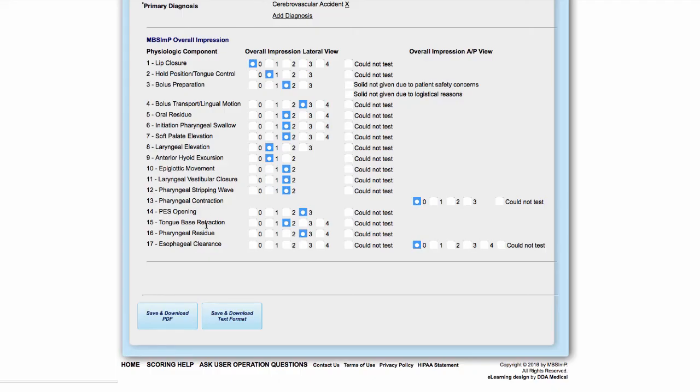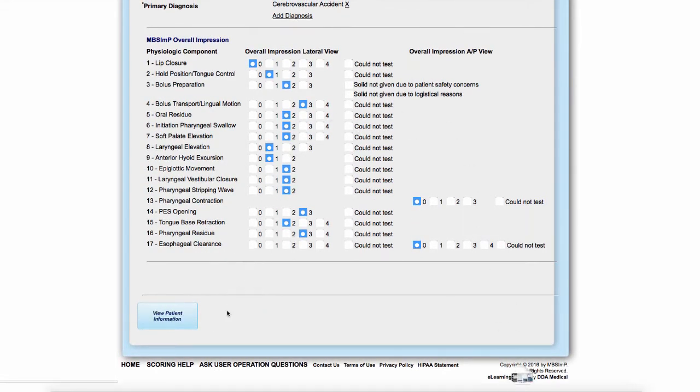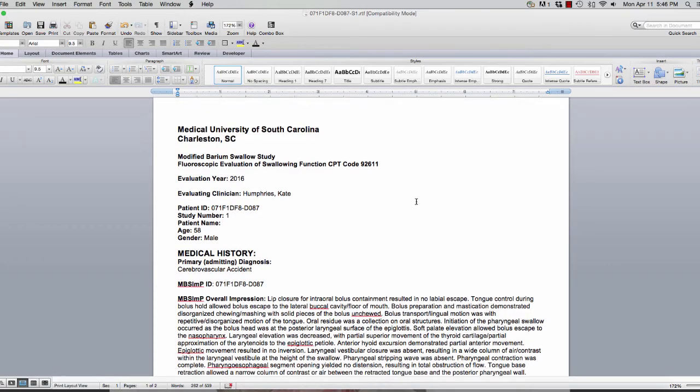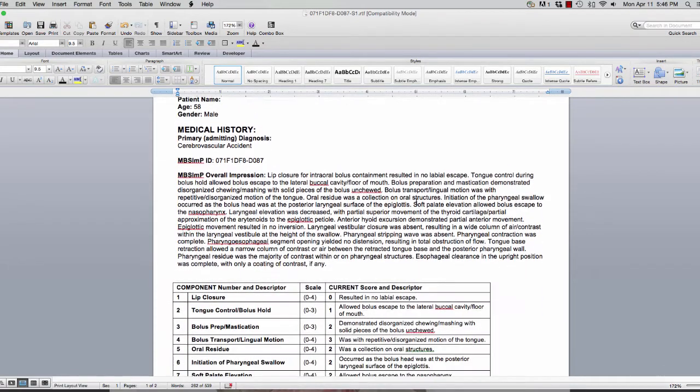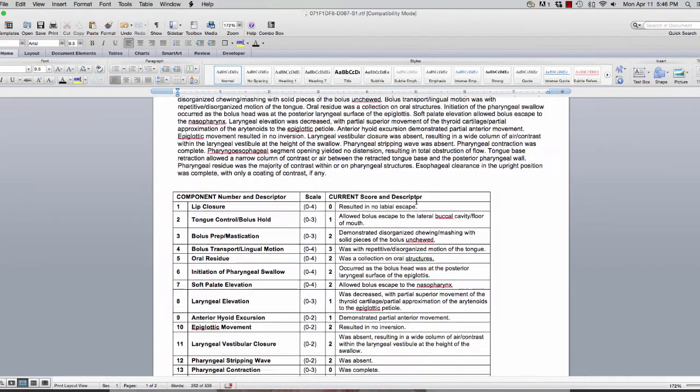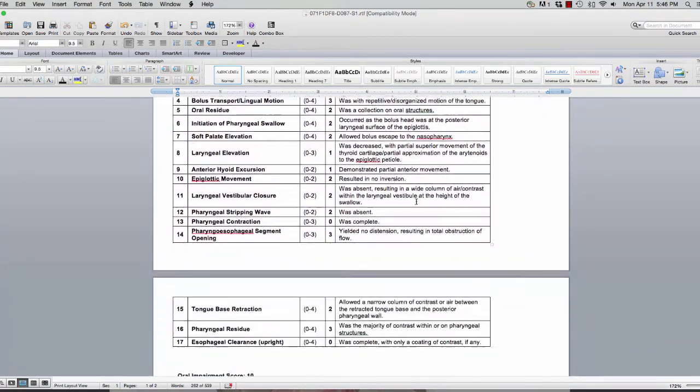If your EMR does not support images, you can download a rich text format of the report that can then be pasted into the patient's medical record.